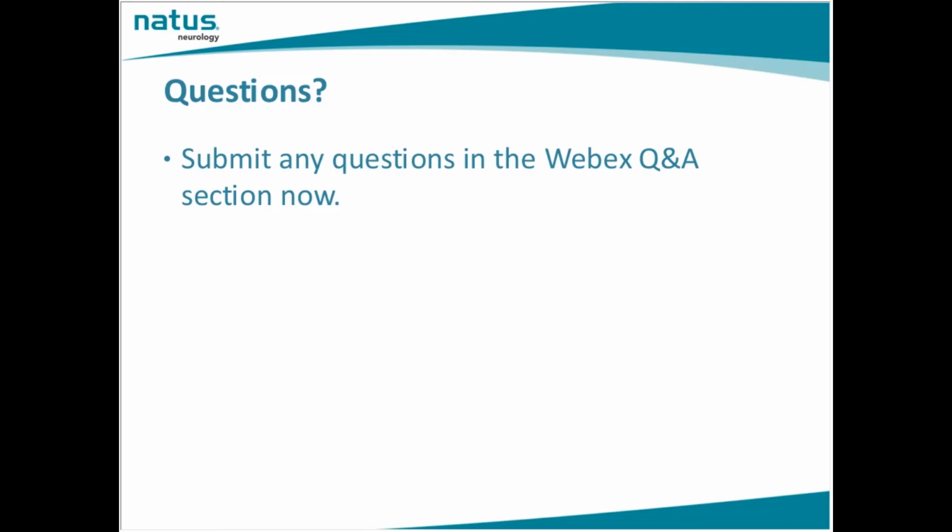So, Donna Lee, the question is, can you monitor TCD and EEG at the same time together? Good question. You can, Katie, but you have to make sure that before the EEG people, the neurodiagnostic people, get in there, you mark your temporal bone. They use a temporal lead, so they're going to put a lead on the temporal bone. You want to make sure that you secure your window first.